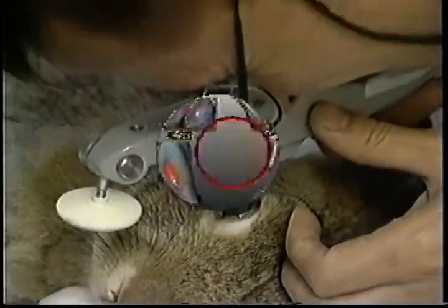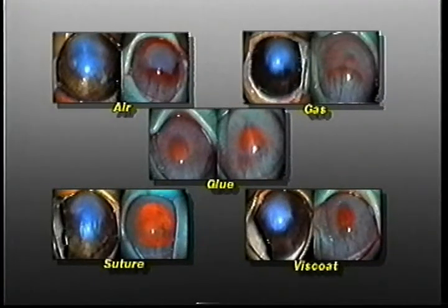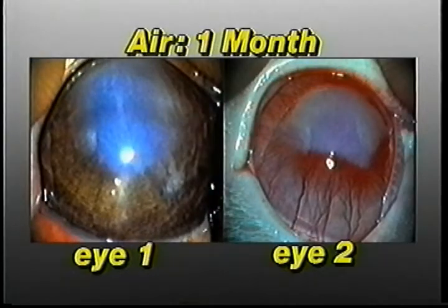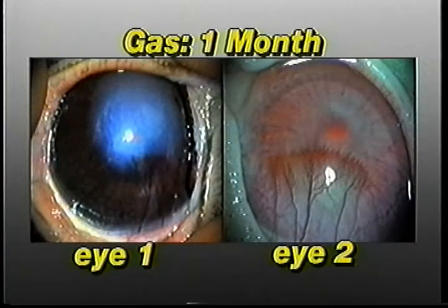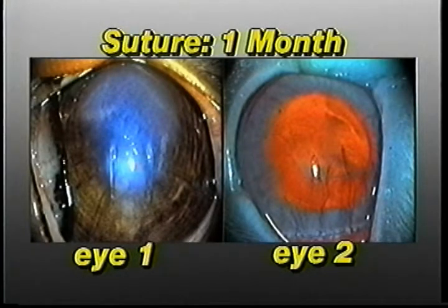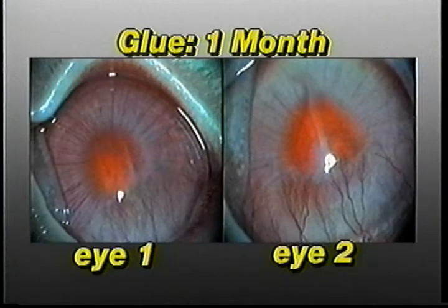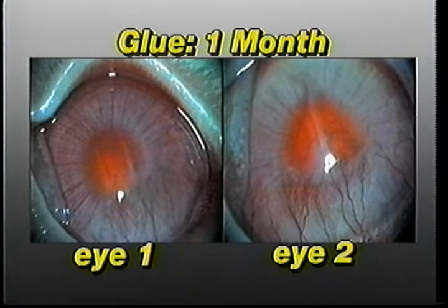In all 10 eyes tested, there was no intraocular pressure increase in the postoperative period. When comparing the five types of Descemet's opexies, there was no doubt that the one with better results was definitely the organic glue. With air, the Descemet's membrane didn't reattach in either eye. The gas reattached the membrane in eye 2; however, there was a certain degree of endothelium deficit, which could represent a toxic effect. The suture worked perfectly well in eye 2, as did the Viscoat. But the glue provided complete reattachment in both eyes. In eye 2, the gap left by the Descemet's membrane was covered by a whitish tissue, which might have been a deposition of fibrin.